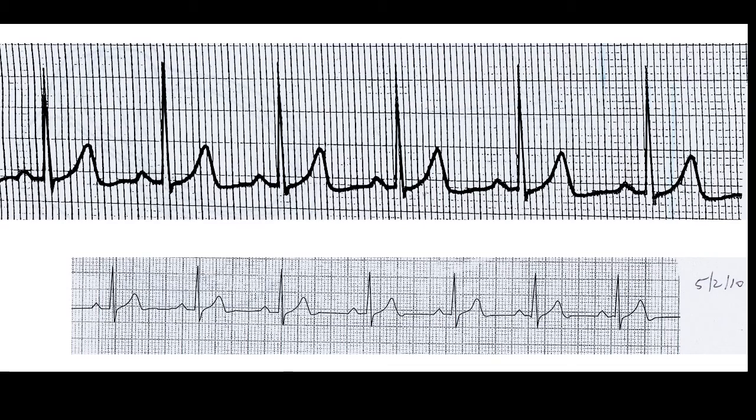And again, do the conversion on the math for that. So be sure that you're able to do these skills. On the bottom EKG, another practice example, you could look at maybe the third beat over would be good.